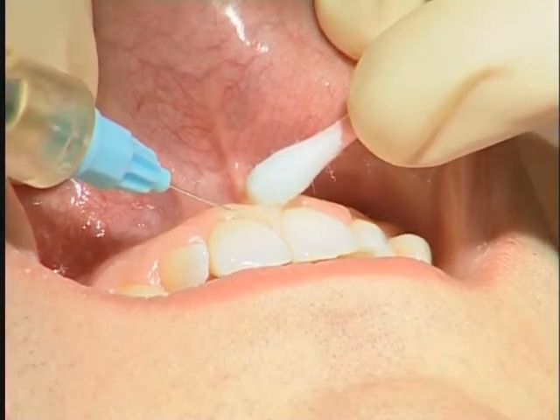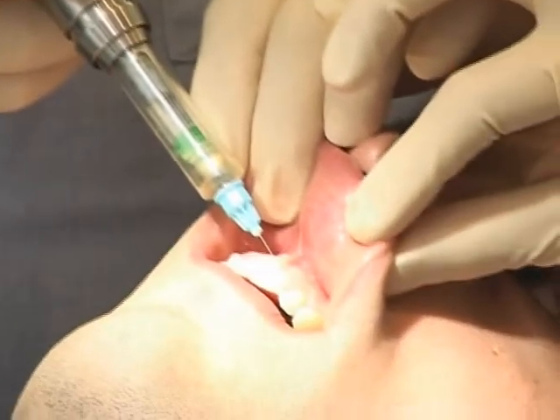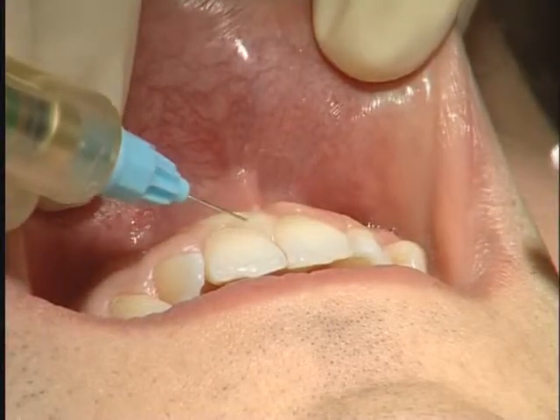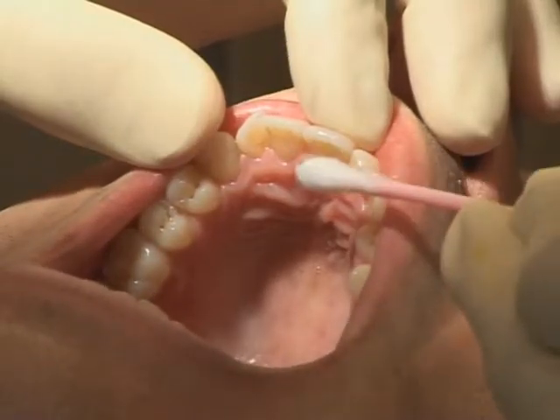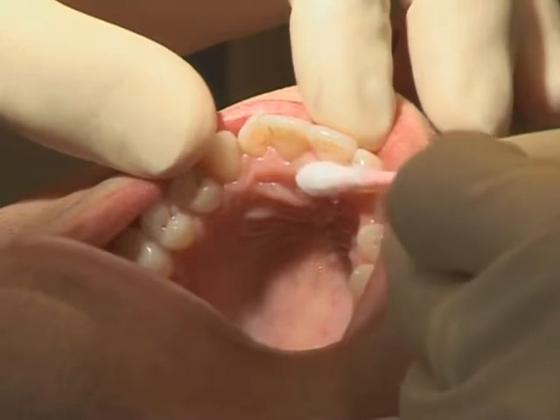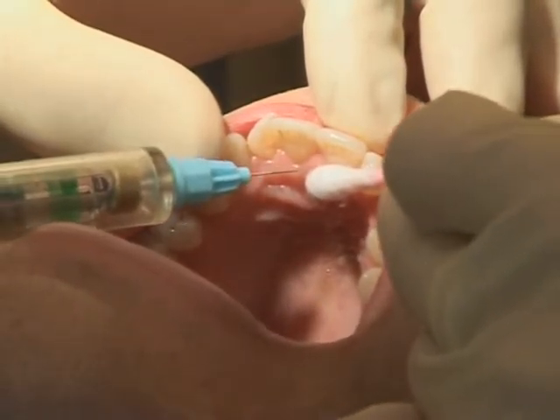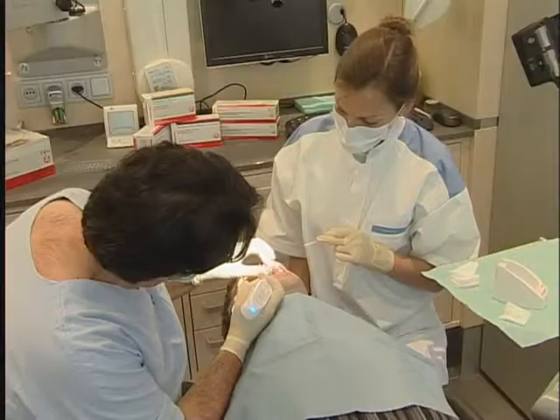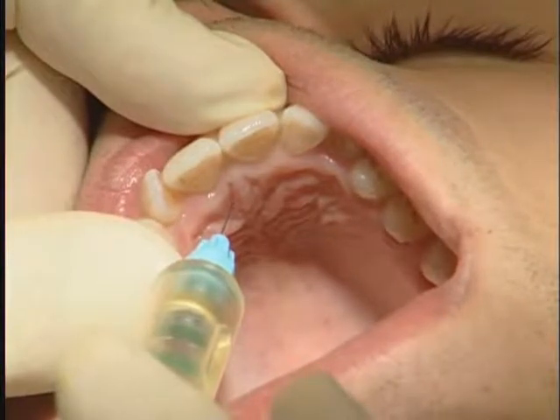To achieve this painlessly, infiltrate the medial interdental papilla on the buccal side first and then the palatine side. Use a cotton stick to compress the area. This stimulates the large diameter nerve fibers and obscures the pain perception. This strategy means you can reach the incisor papilla and access the incisor canal.